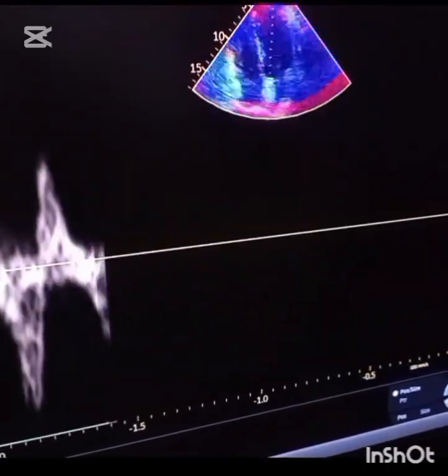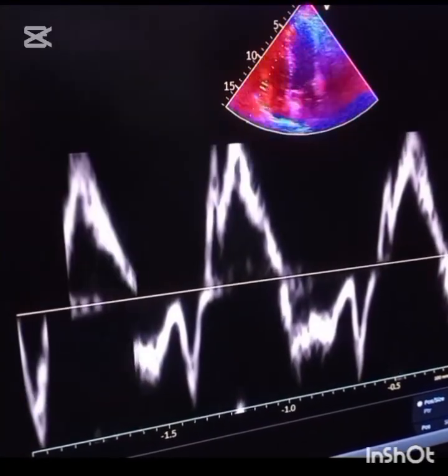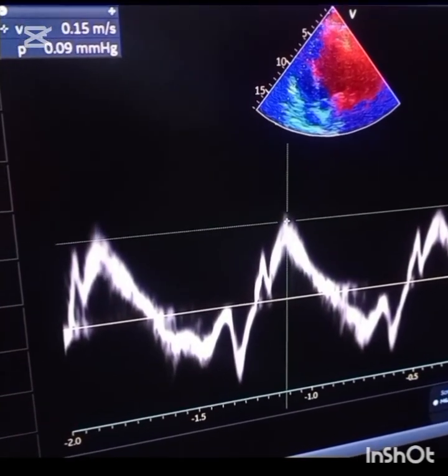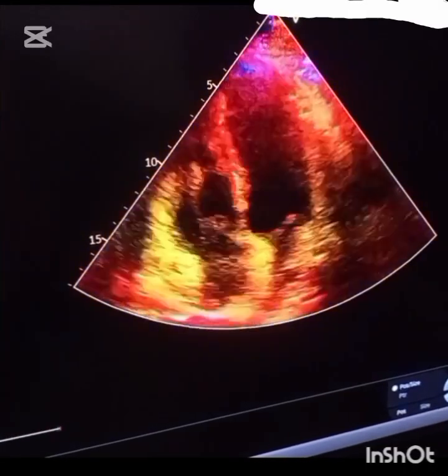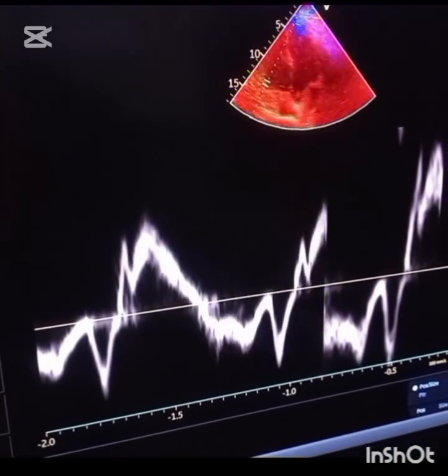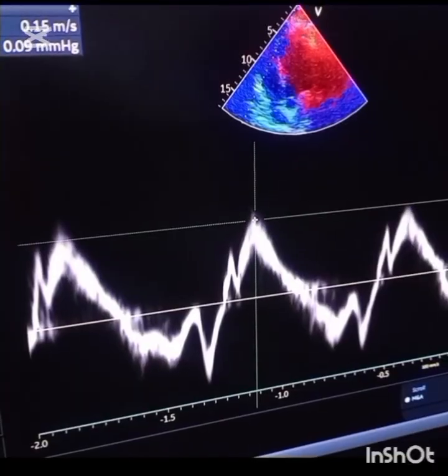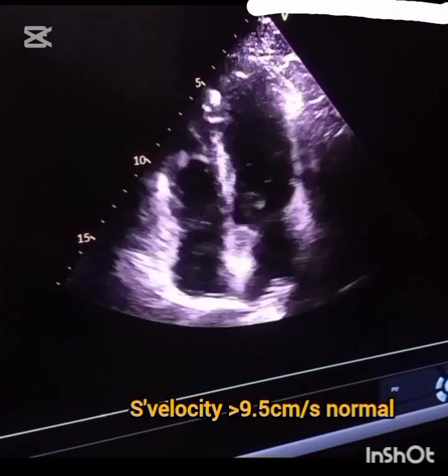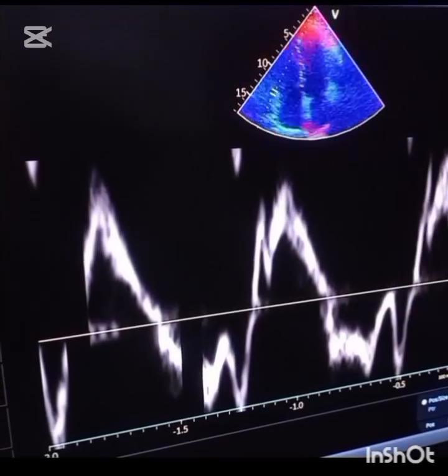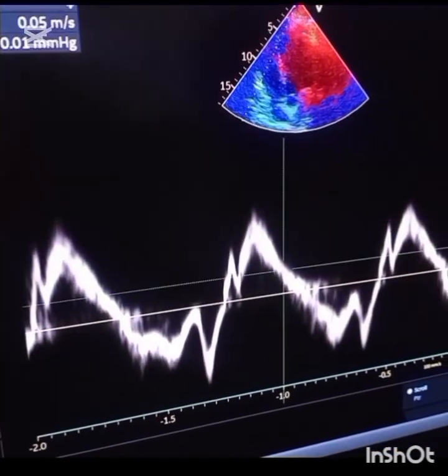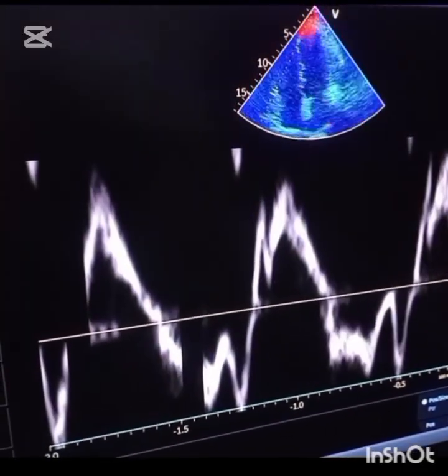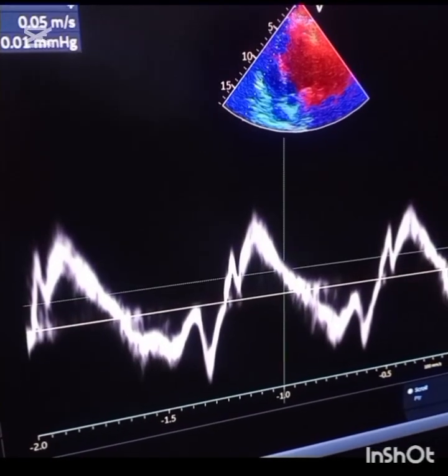To measure it, activate the TDI mode as seen in the video. Place the pulsed wave Doppler at the lateral annulus and measure the peak velocity in centimeters per second. In this case the machine gives meters per second — the reading is 15 cm/s, which is normal. A velocity above 9.5 cm/s is considered normal. Here we have 15 cm/s, so this is a normal case.